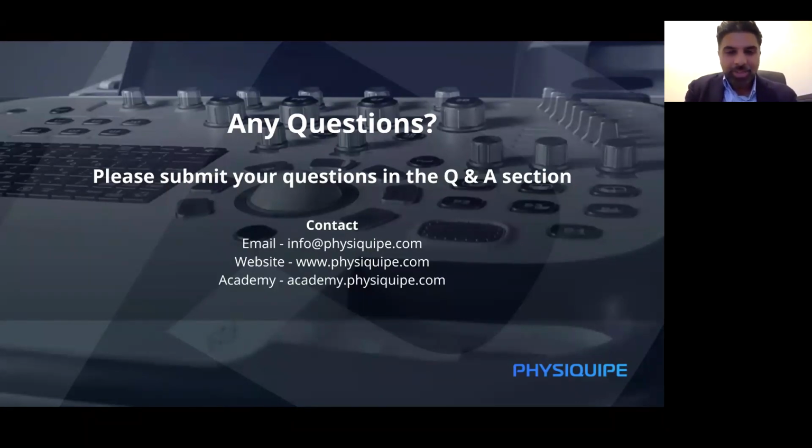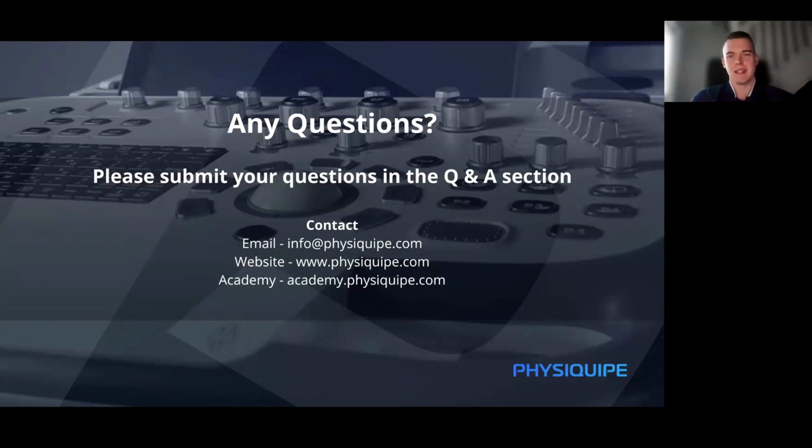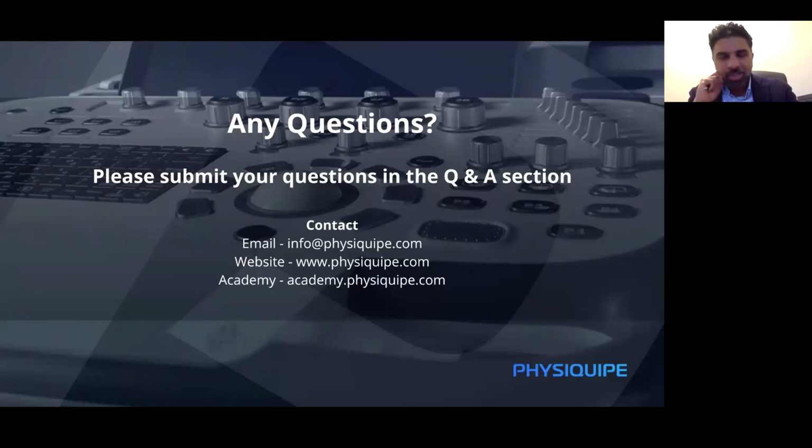And through that accuracy, you avoid complications and any sort of adverse outcomes from injections. So you're not going to hit a nerve, for example, or whatever it may be. So the evidence at the moment is that it may not improve someone's long-term pain, but in terms of accuracy and reducing complications, yes.